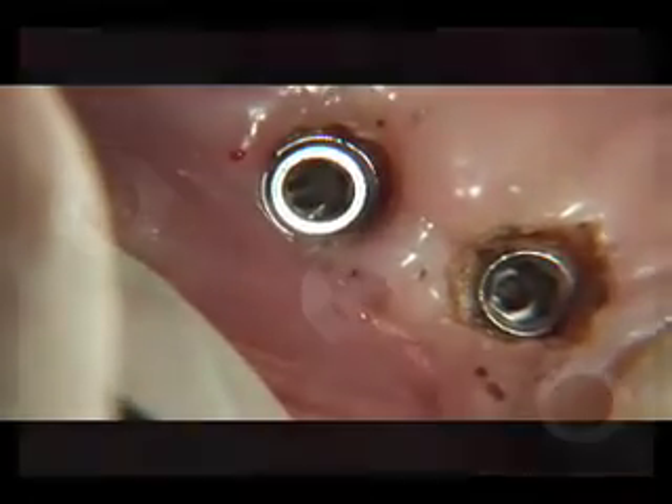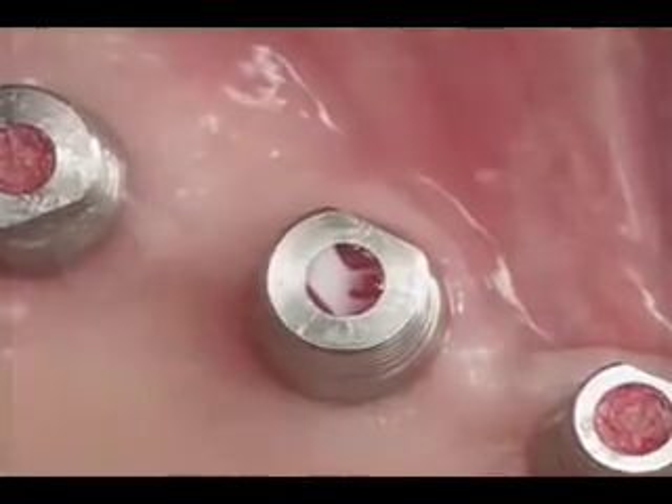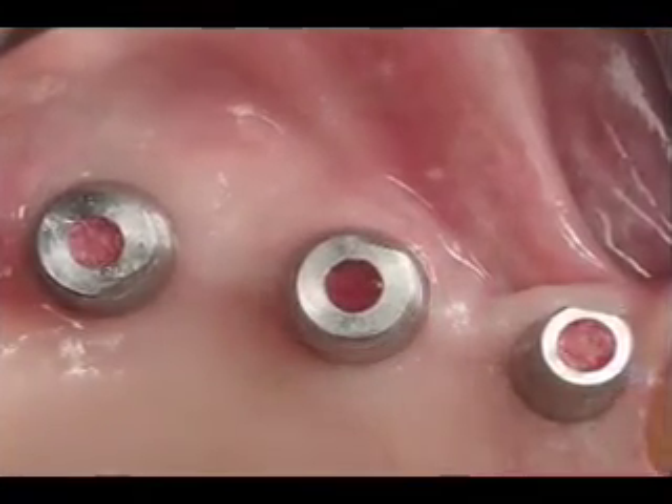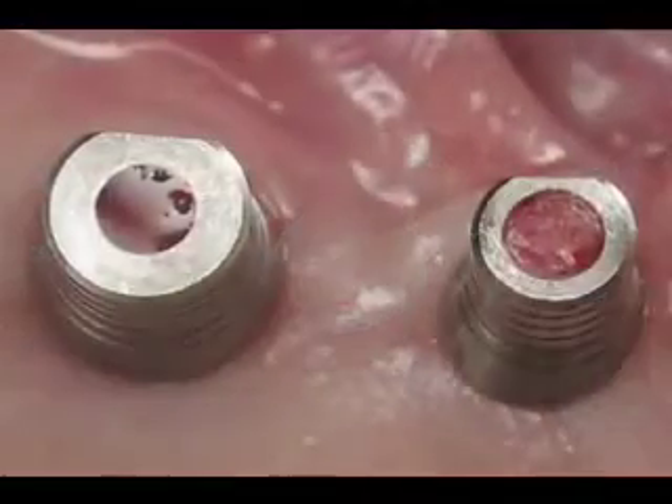During the two week time frame required to fabricate the restorations, there may be some rebound effect of the tissue around the retainer, and in this case another round of light troughing will be necessary prior to cementing the final restorations.